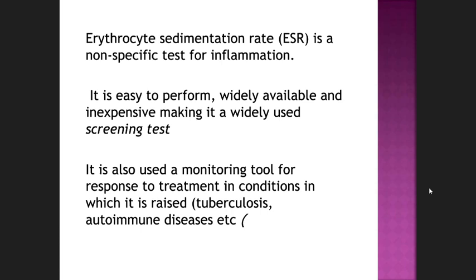Basically, we can then infer from that the various conditions, which can give a probable idea of what could be the reason. So it's not coagulation, it's about sedimentation. The name itself says it's sedimentation. Okay.